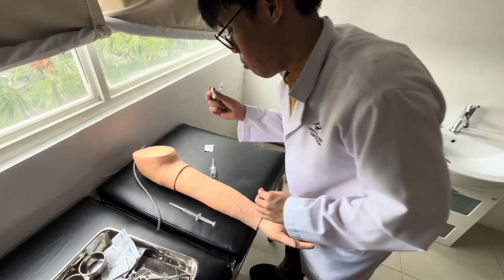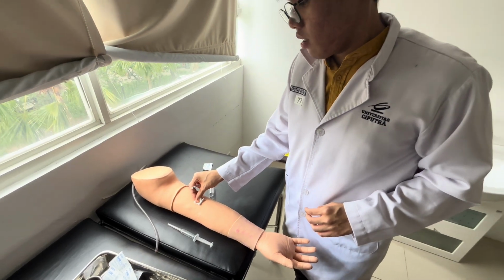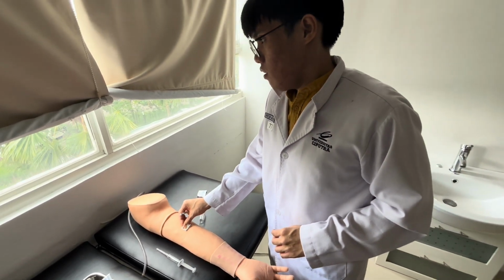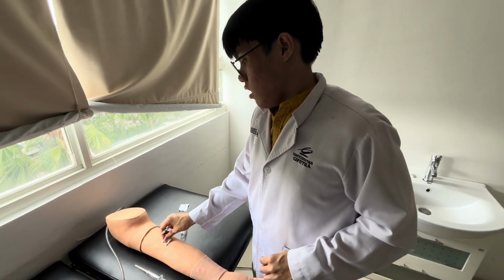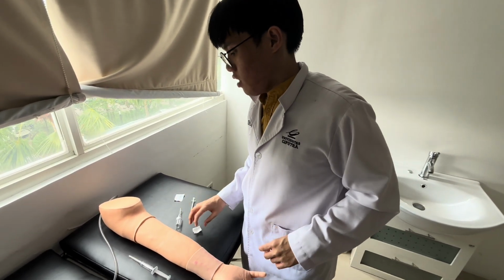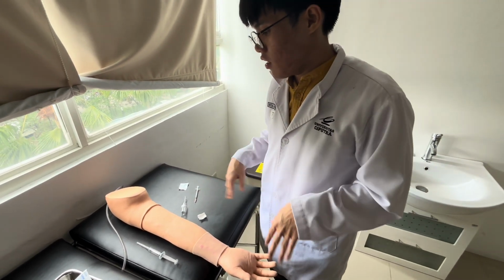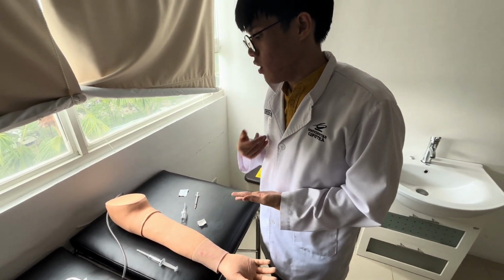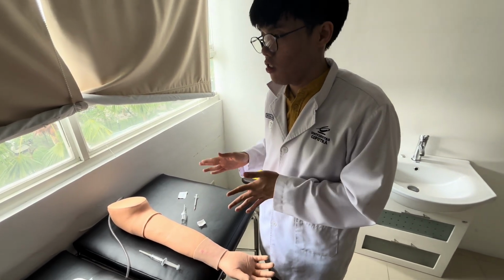Okay, and then you will apply pressure with the alcohol swab on the puncture site for around 2 to 5 minutes, and afterwards you will throw away the syringe and then wait 10-25 minutes, and analyze if there's any redness, any swelling, or any itchiness on the punctured area. And if there's none of that, then you're good to go.